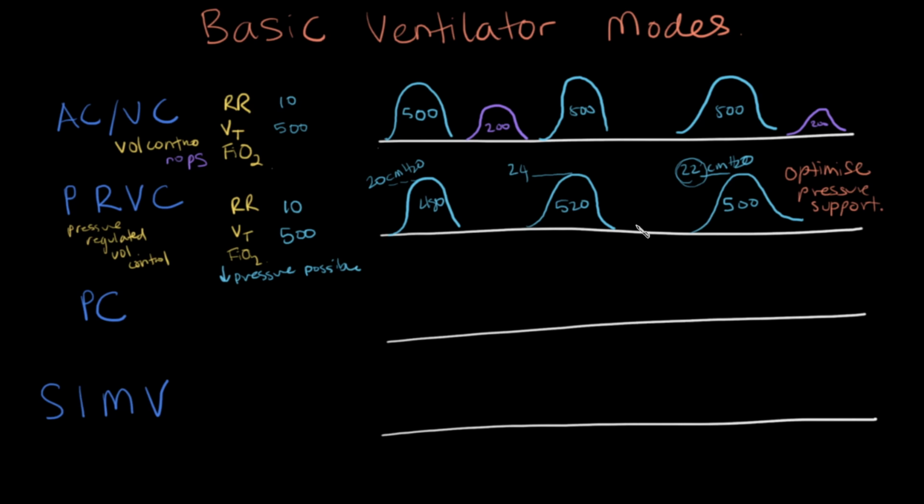And we can start to see, like I said, if patients are starting to require higher and higher pressures to ventilate, or conversely, lower pressures, which may signify that the patient's condition is improving.